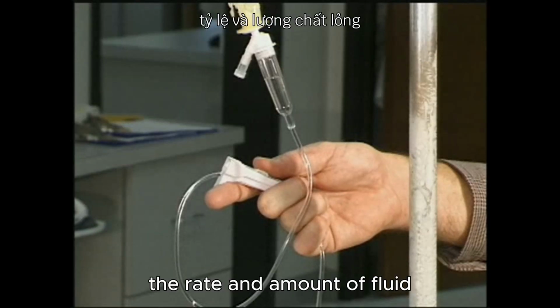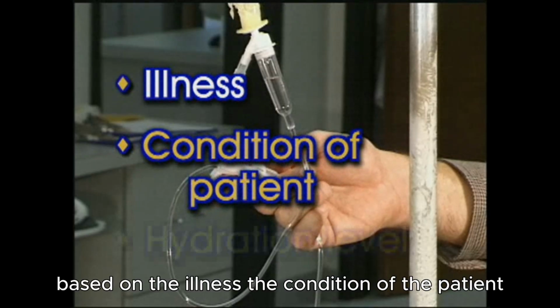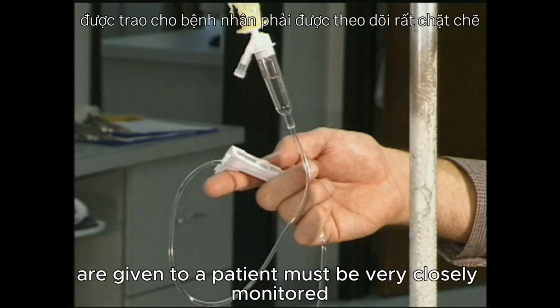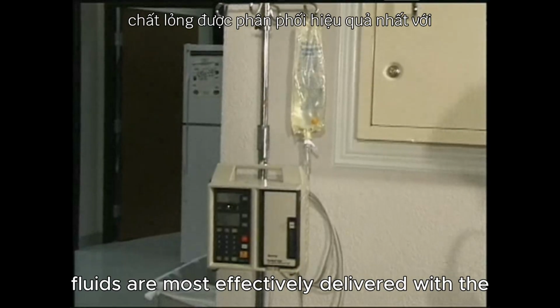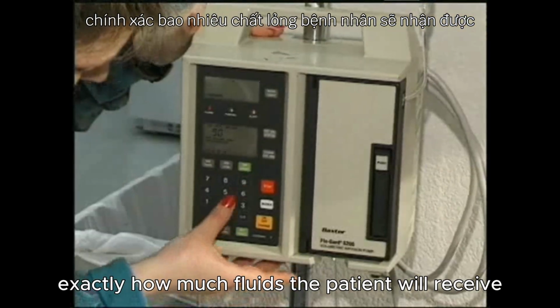The rate and amount of fluid the patient needs is determined by the veterinarian based on the illness, the condition of the patient, hydration levels, and several other parameters. The rate at which fluids are given to a patient must be very closely monitored. Fluids are most effectively delivered with the aid of a fluid pump. Such pumps accurately regulate exactly how much fluids the patient will receive.